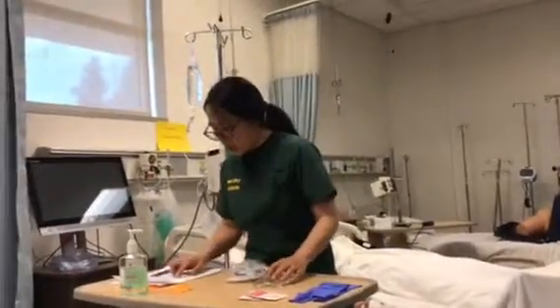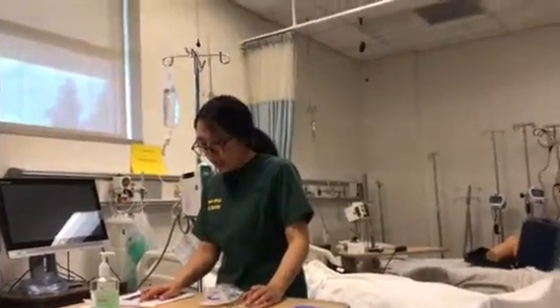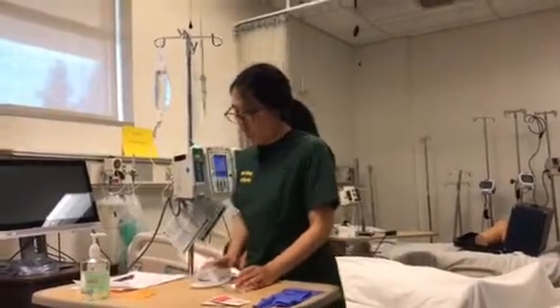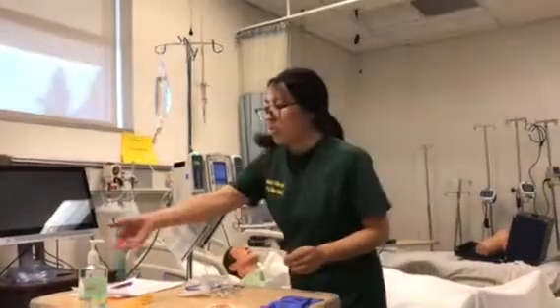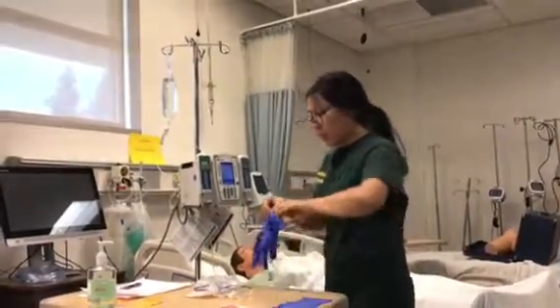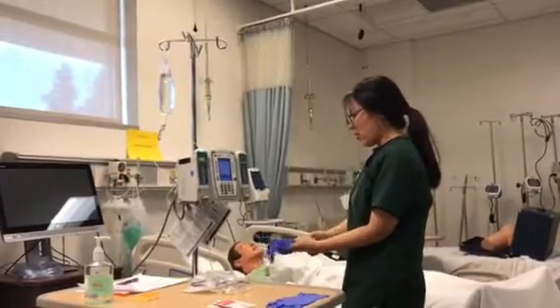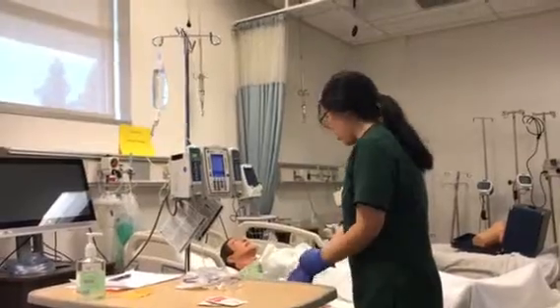So the medication I got is cefazolin, 2 grams in 100 milliliters, and the rate is 100 milliliters in 1 hour. So after that, I'm going to do hand hygiene, wear the gloves, and check the patient. First I will verify the patient by her name and the MRN.